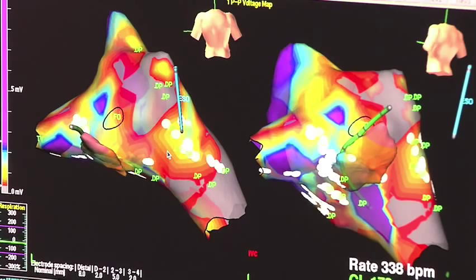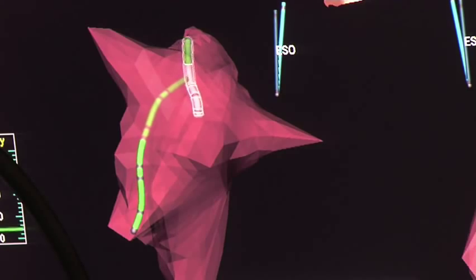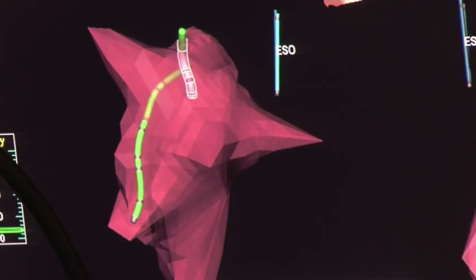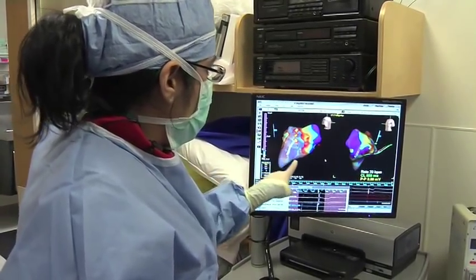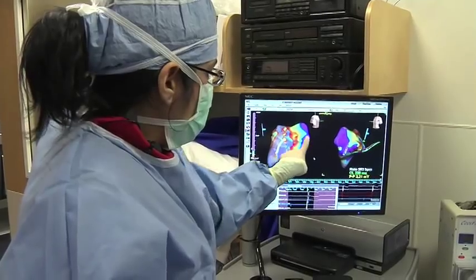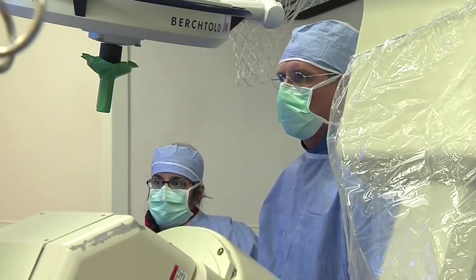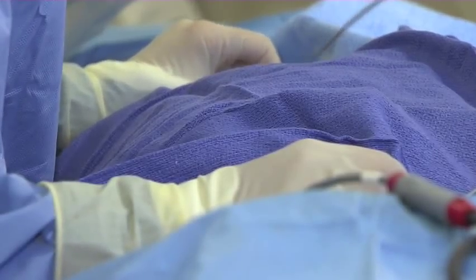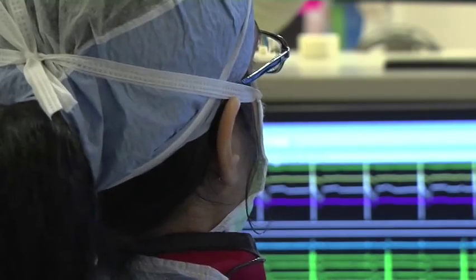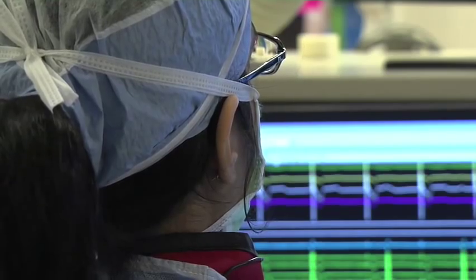For patients who have had extensive surgery on the atrium, which our patient this morning had, they are about the most complex things that we see. What we've done here is we've actually mapped out the areas of scar, and those are the areas in gray. Procedures of this complexity really require two electrophysiologists to be in the room to work through them. One person with a catheter in their hand, the other person making measurements, doing pacing, and studying the map.